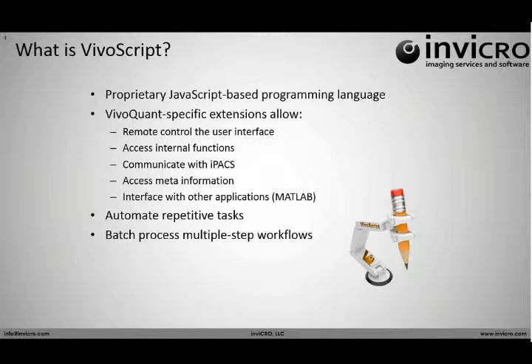What I'm going to do is introduce VivoScript and then talk about the quick access toolbar, which is in the top right, and you may have seen it or used it. First of all, what is VivoScript?